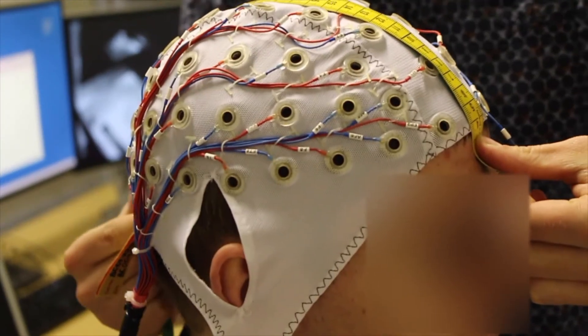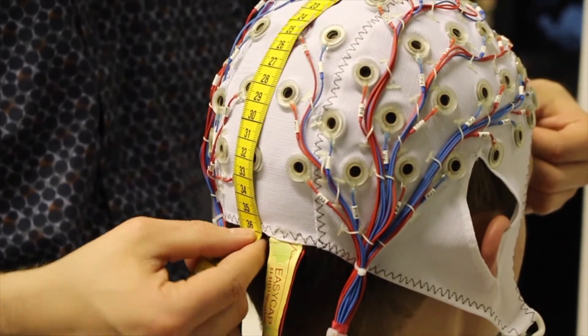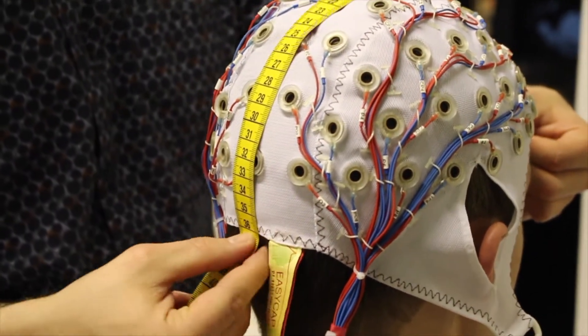Next, you should measure from the nasion, which is between the eyebrows, to the inion, the bump on the back of the skull, and make sure that electrode CZ is at the midpoint of the two.